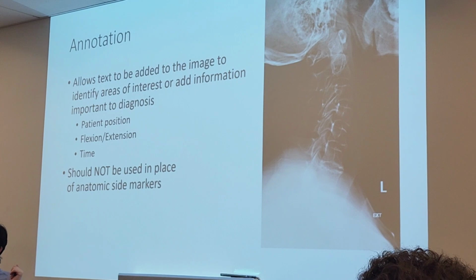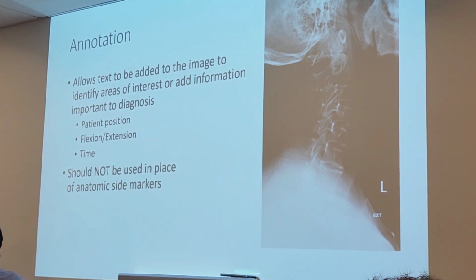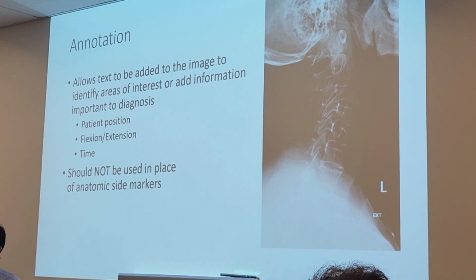All right, so small bowel follow through. Think of an upper GI exam, right? After the upper GI exam, there's barium in the GI tract, and the barium makes its way through and comes out the other end. But some people are constipated and it takes a while for it to go through. Some people may have an obstruction, maybe intussusception, maybe volvulus, something like that to keep it from traveling through.